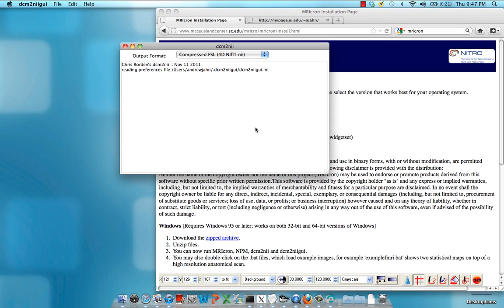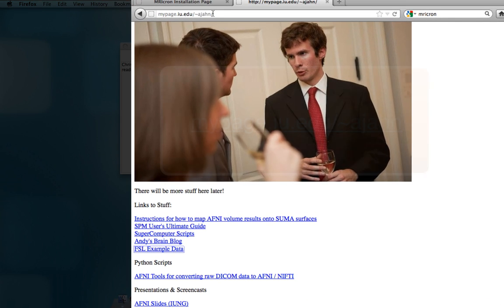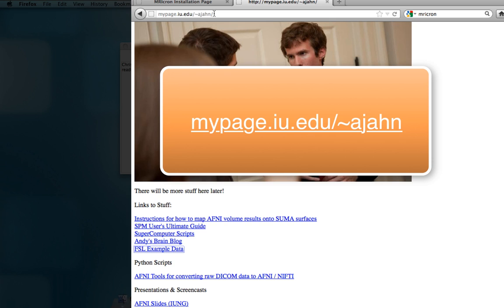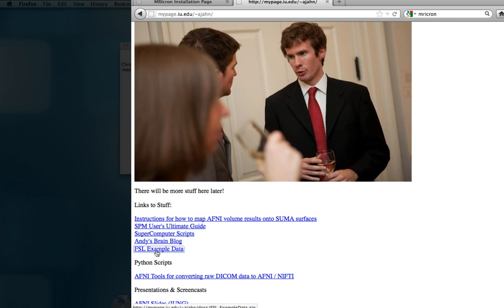Now that we have DICOM to NIFTI set up, all we need is some raw fMRI data to convert. I've provided some on my webpage, which is mypage.iu.edu slash tilde ajahn. Go to the links and click on FSL example data to download a sample data suite.